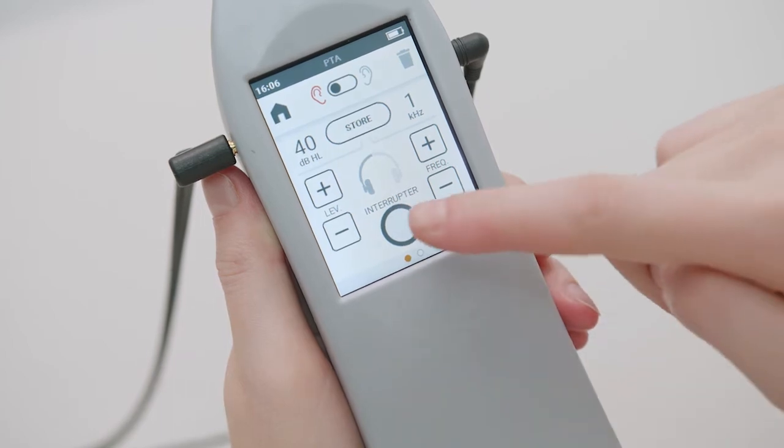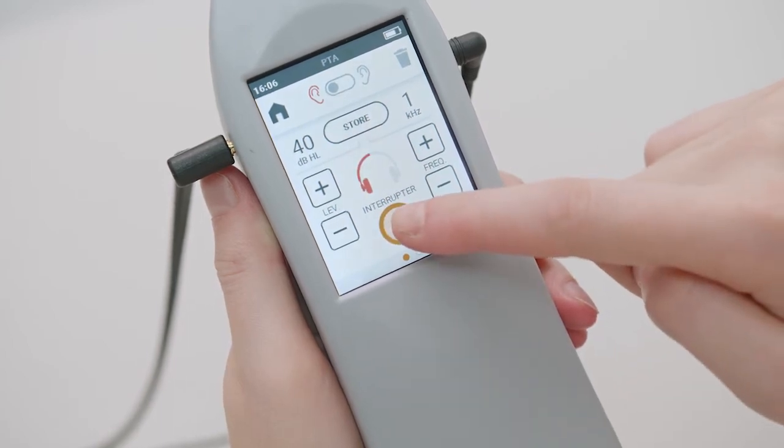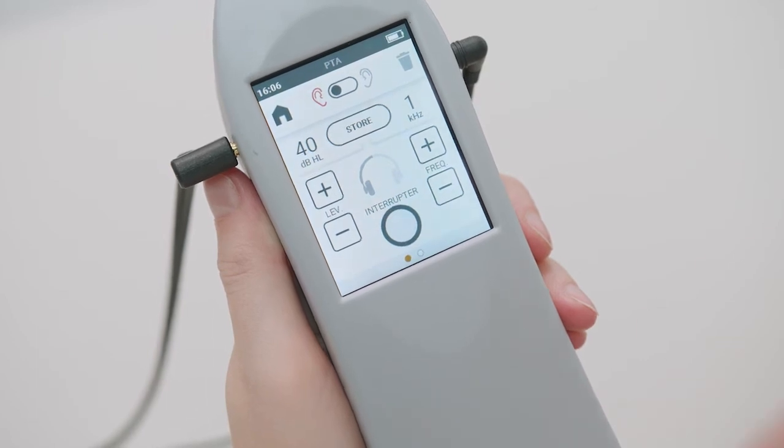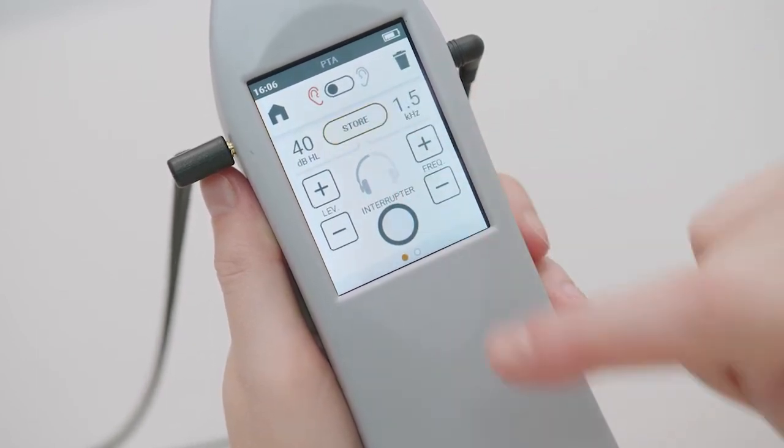The transducer icon shows in red or blue when the stimulus is actually transmitted. Using the store button you can save the current level as an auditory threshold for the frequency under investigation.